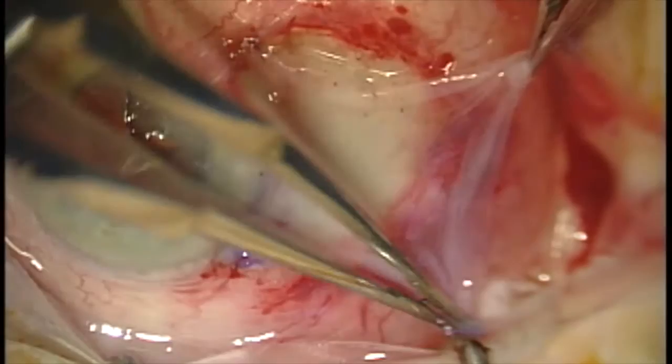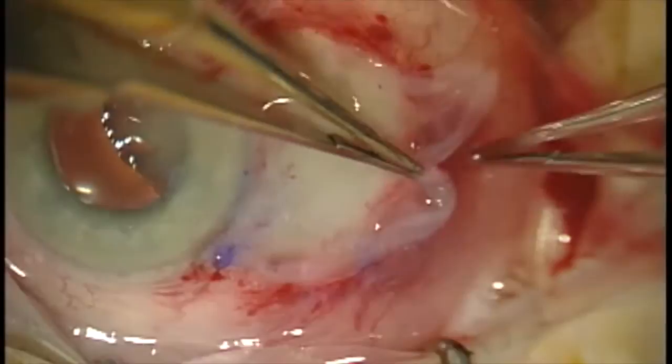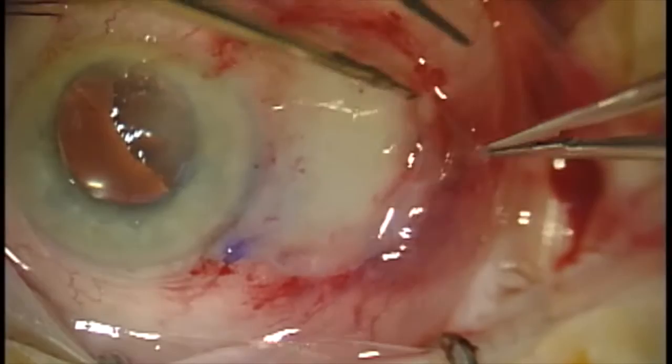The graft can then be quickly reflected into position and smoothed into place. The graft is a little bit bigger than the defect, but I think that's actually beneficial. We go ahead and tuck the graft in underneath the cut edges of the conjunctiva. The graft will dissolve over the next few weeks and this area will be covered with conjunctival epithelium eventually.